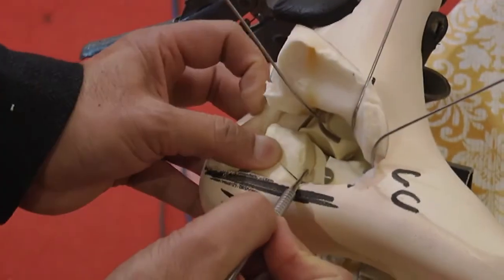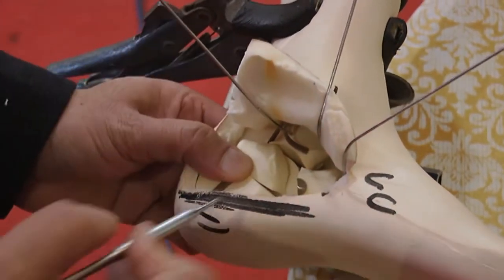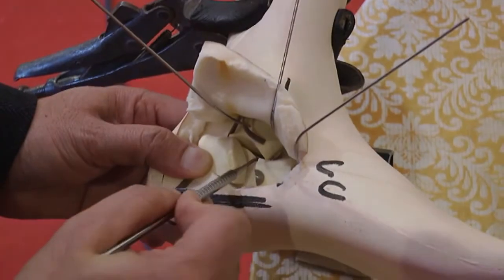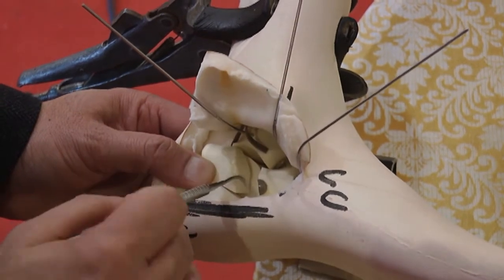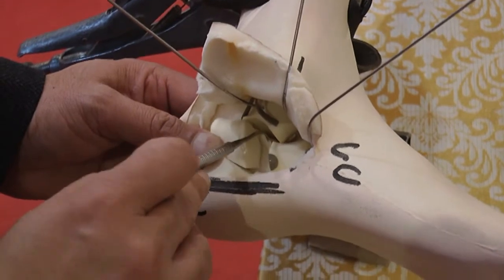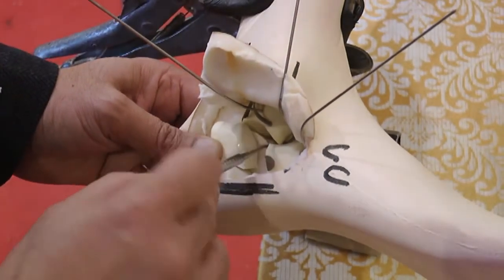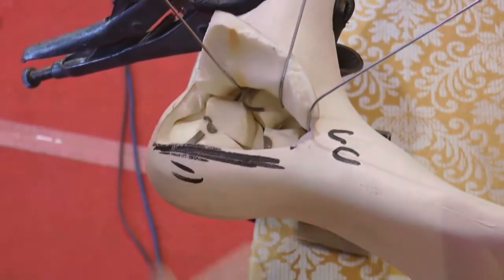So you see, this is the general configuration. The medial wall, the medial fracture line is in place with the stable sustentacular fragment, and the lateral facet is depressed, which was covered by the lateral wall. Having removed the lateral wall, by inverting the heel, you are now able to see the medial fracture line, and that is the fragment which has to be lifted. That is the next step.